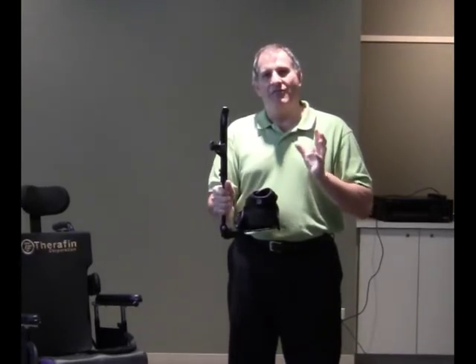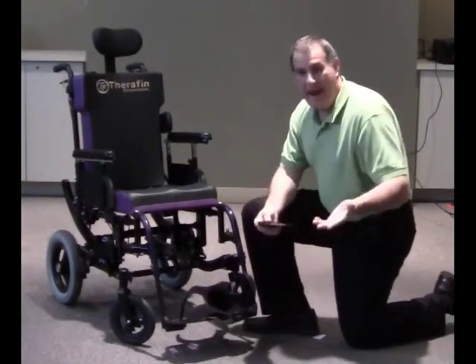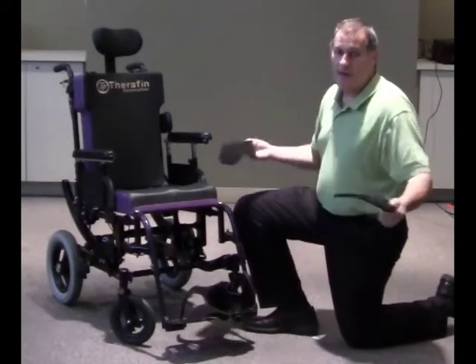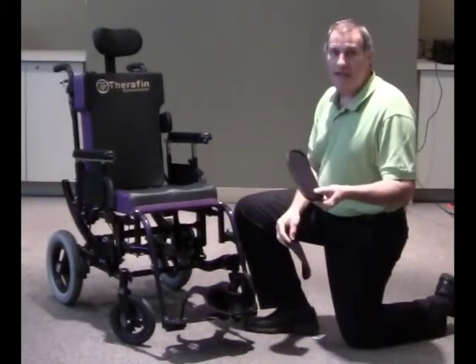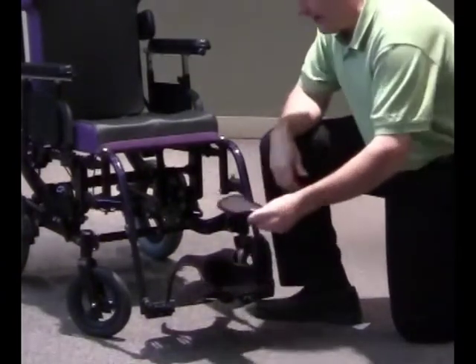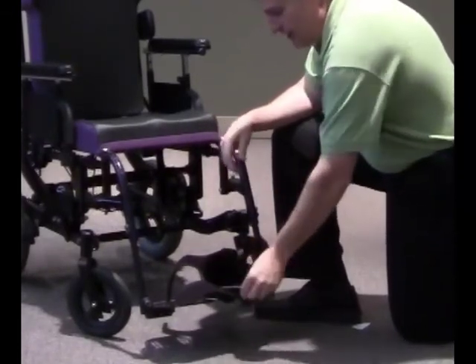We're going to now show you the Flex Your Feet in action. Once it is in place and mounted on the foot plate, you may have an individual who's wearing shoes and want to leave the ABS plate exposed. But if you have an individual who's going to use it with a socked foot or bare foot, you may want to add the optional padded insert. The insert is a Velcro piece which attaches on top of the ABS plate, and the padded insert can be removed, Velcroed into place, and then easily removed.